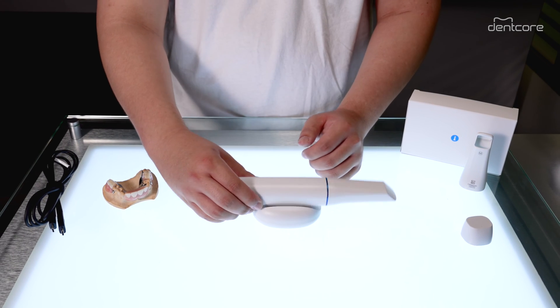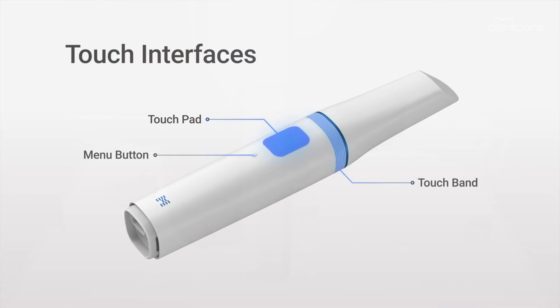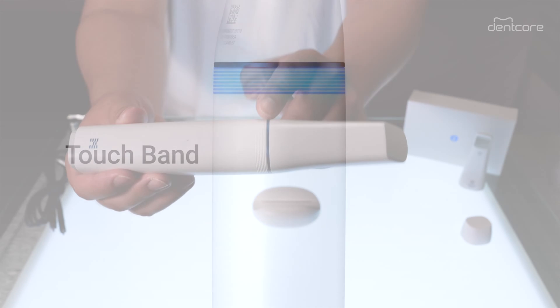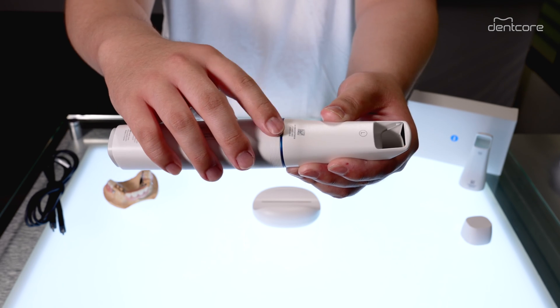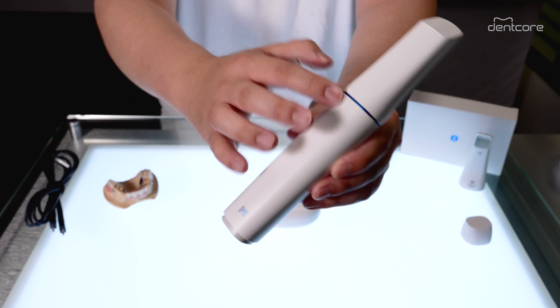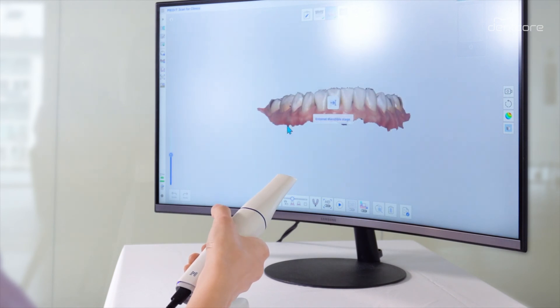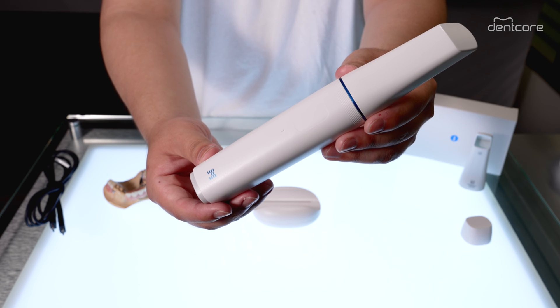The Medit i900 replaces the button-controlled scanners of the past and now has a new touch-activated interface. The 360-degree touch band offers control from any direction. Simply double tap to start or end the scan, which enables you to scan from any angle, adding unparalleled flexibility to the scanning process. Swiping the touch band right and left allows you to move to the next or previous scanning stages — navigating your screen is as intuitive as using your smartphone.